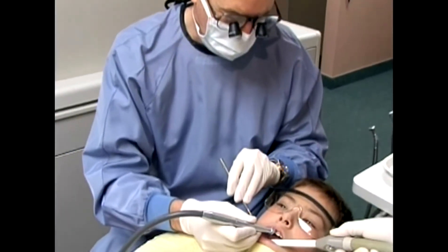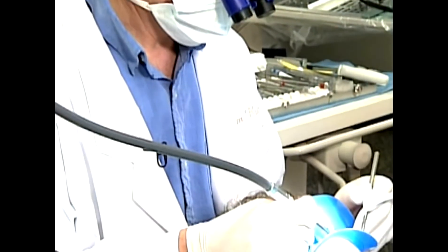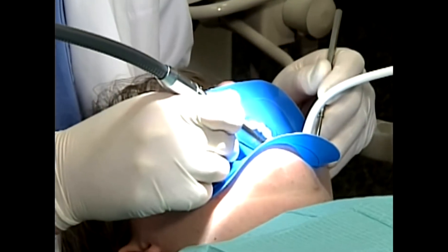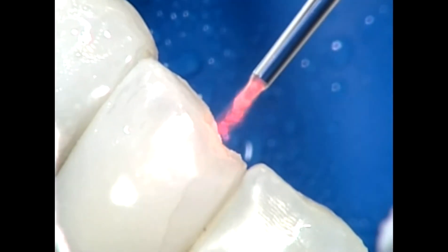Because there is no vibration and detrimental heating, the laser cavity preparations require minimal to no anesthesia. A new laser dentist should introduce anesthesia-free procedures only after they have mastered laser settings, cutting, and all basic technical skills related to laser cavity preparations.